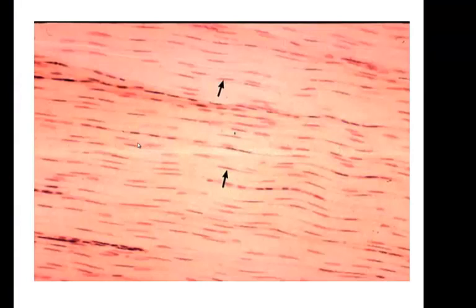Let's look at another picture. Here's another one. Same exact tissue type. And this one is great because it is showing you these little slit-like nuclei. The collagen fibers are all running together here. It's the pink in the background. But you can see how here's a slit-like nucleus. Here's one, here's one, here's one. You can see all the nuclei of the fibroblast lining up in one row. This is your big indicator that you're looking at dense regular connective tissue.